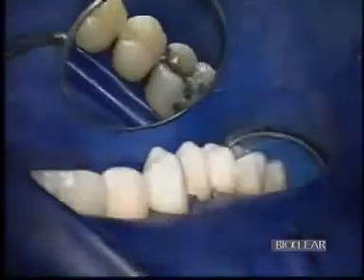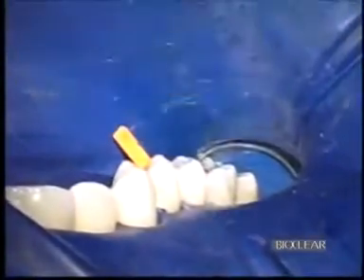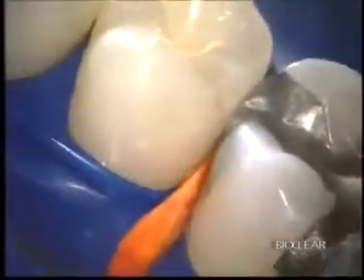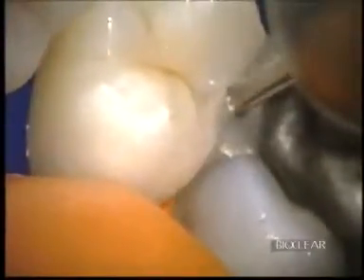Let's start with a clinical Class II case. Christy had incipient distal caries on her upper second bicuspid. Part of modern composite dentistry today is careful management of soft tissues. We also like to lightly stretch the periodontal fibers while we are preparing the tooth. We accomplish both goals with the use of an old-fashioned wooden wedge placed preoperatively. So before I begin to prepare the tooth, my assistant will place the pre-wedge.